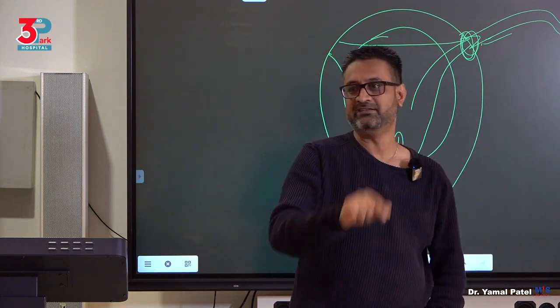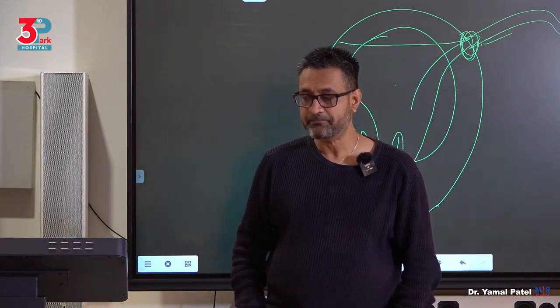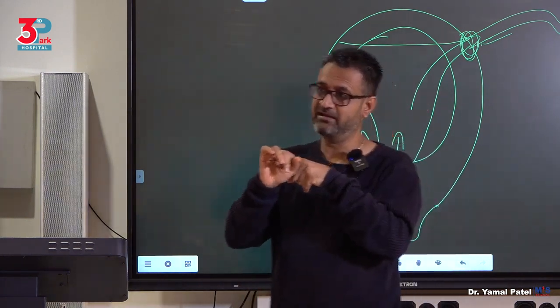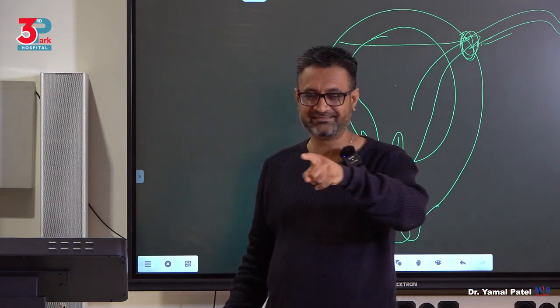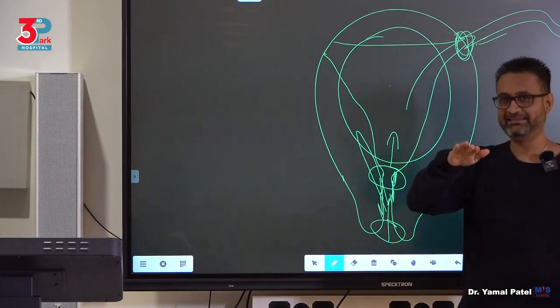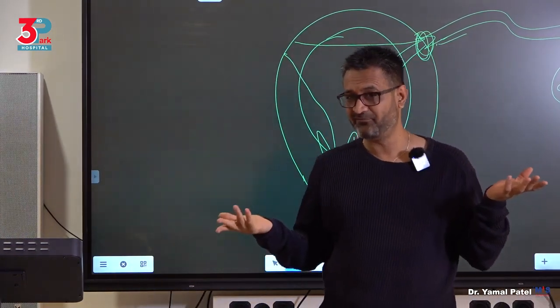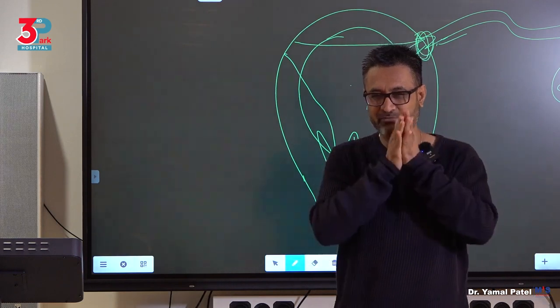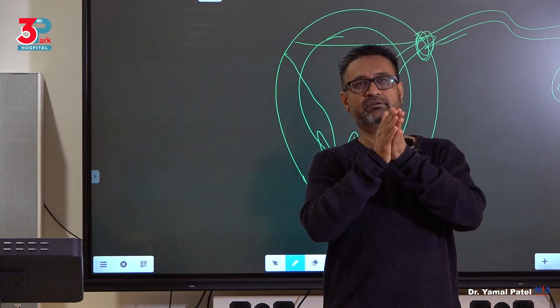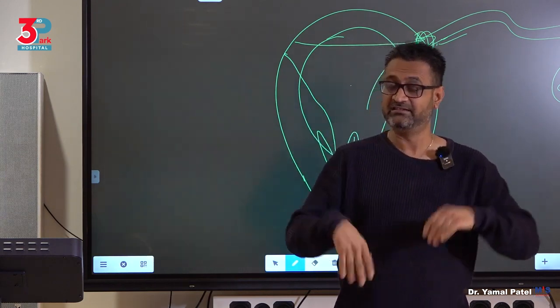and then you go into the uterine cavity. You've understood? Under vision. Now, once you enter into the uterine cavity, you follow the track of this. So whether it is anteverted, retroverted, irregular, it doesn't matter. I'm following the view, and I'm pushing only when I can see. When I don't see, I'll stop again, I'll look around, and it's okay here. Then you go ahead. If there's stenosis, doesn't matter.